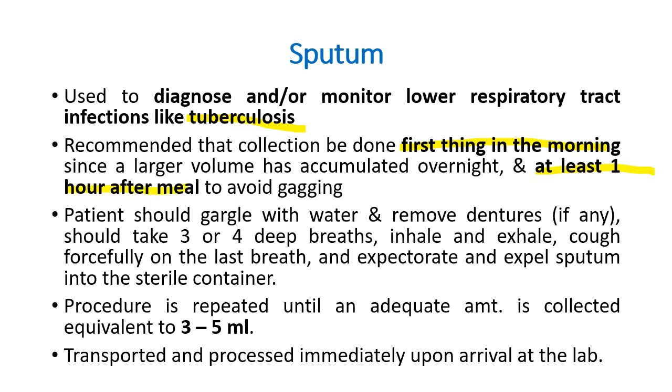to avoid gagging. So, patients should gargle with water and remove dentures if any, and should take 3 to 4 deep breaths, inhale and exhale, cough forcefully on the last breath, and expectorate and expel sputum in the sterile container. So, ano dapat volume? It's 3 to 5 ml.